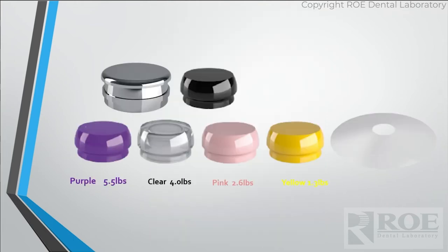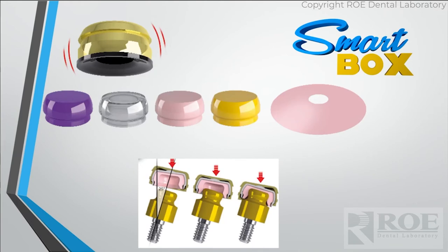Just like all the other systems, Equator comes with all your different nylons — the yellow for processing, clear as your standard, and then you can move between different colors. Because they also wanted to service more divergent cases, they came out with a system called the SmartBox. It's a unique two-metal housing system: there's an outer metal housing and an inner one, with a hump in the middle that allows for pivoting. If you ever see a patient with two metal housings, it's most likely an Equator SmartBox.